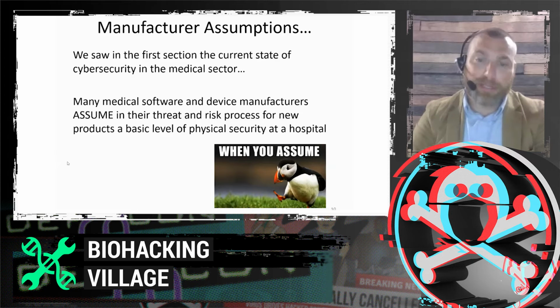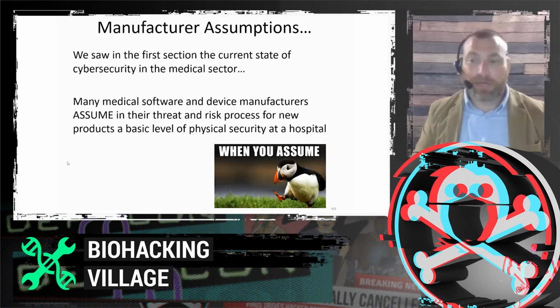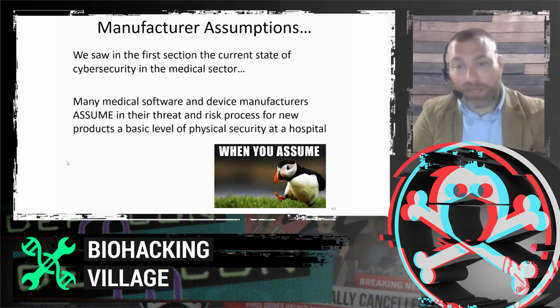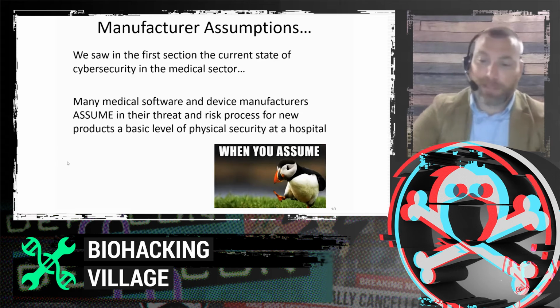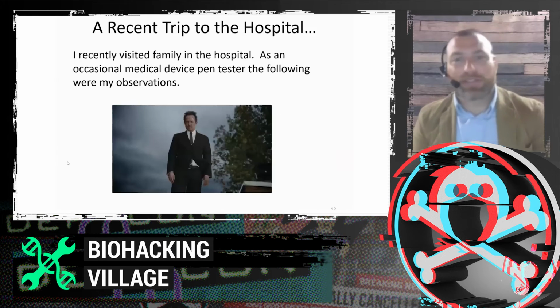But it is understood that certain smaller devices, like point of care devices that can be physically picked up and carried around, or might be in an ER setting or even in a home setting, are obviously going to have less physical security. But you just want to be aware of what physical security assumptions your medical device manufacturers are assuming. Yeah. So, testing those assumptions.